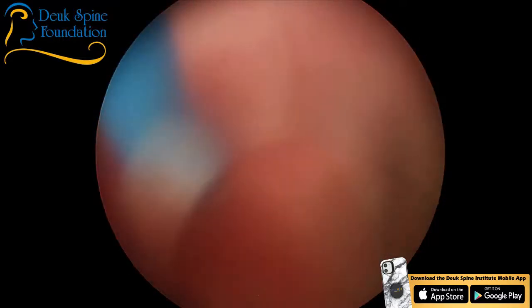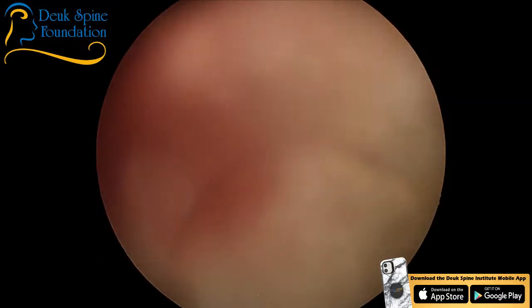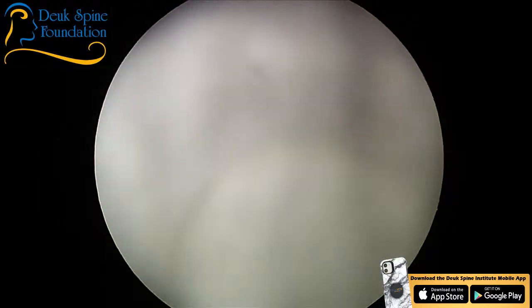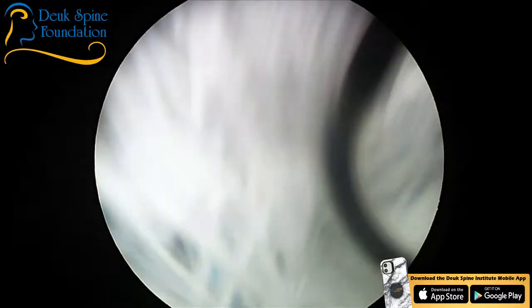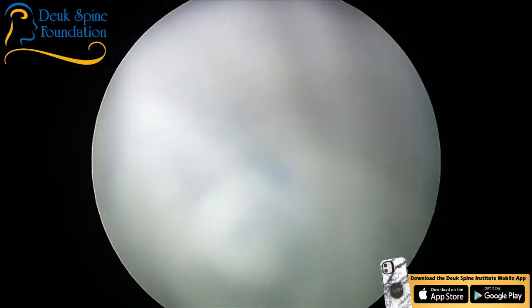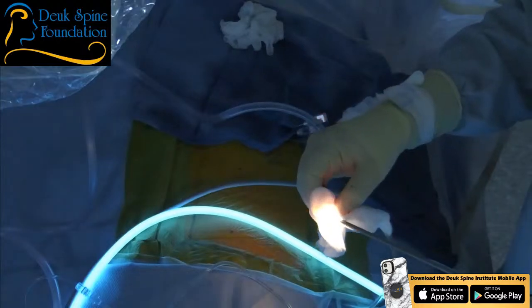Such a weird effect here, Luis. Do we have adequate pressure? Yes. What am I looking at there, Luis? Does that look like a lens issue to you? What do you think? I can tell. I mean, you want a needle scope? Here, hold on. Let me see the radic. What do you think? That looks like a lens issue, right? Let's get another scope.